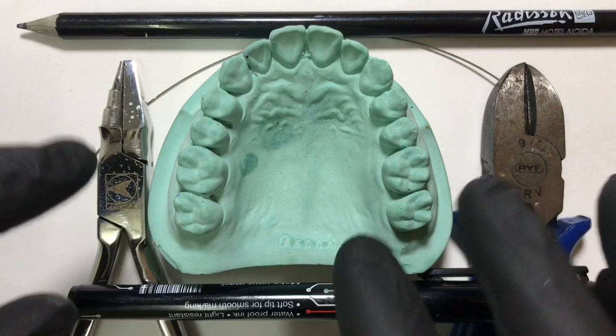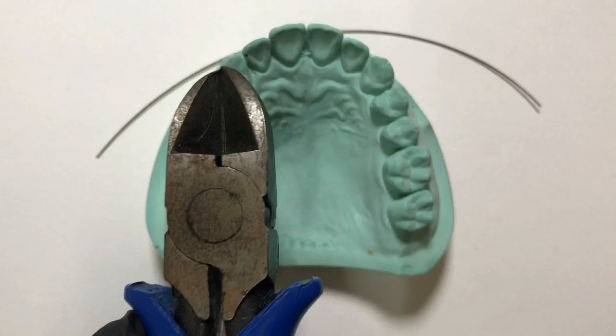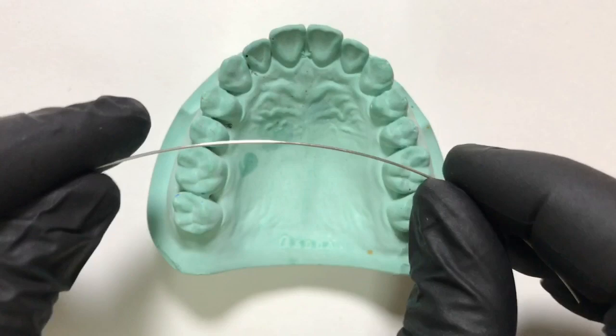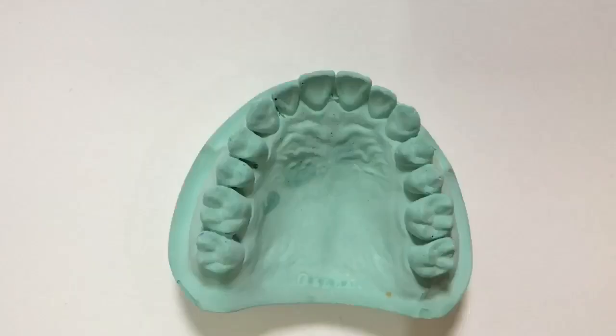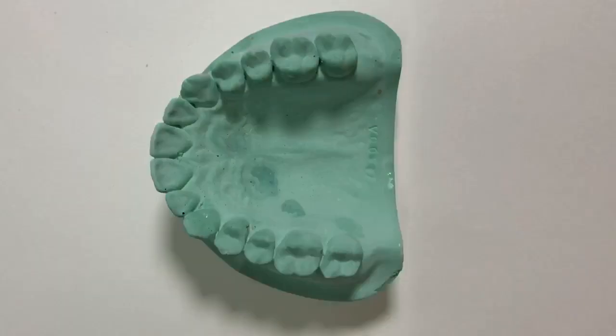Now let's see the things we require for fabrication: a marker pen, a marking pencil, a universal plier, and a hard wire cutter. For fabrication we use 0.6 mm or 23-gauge round stainless steel wire. We are going to learn the fabrication on an ideal adult dentition cast on tooth 2-3, that is the canine. Let's begin with the markings first.